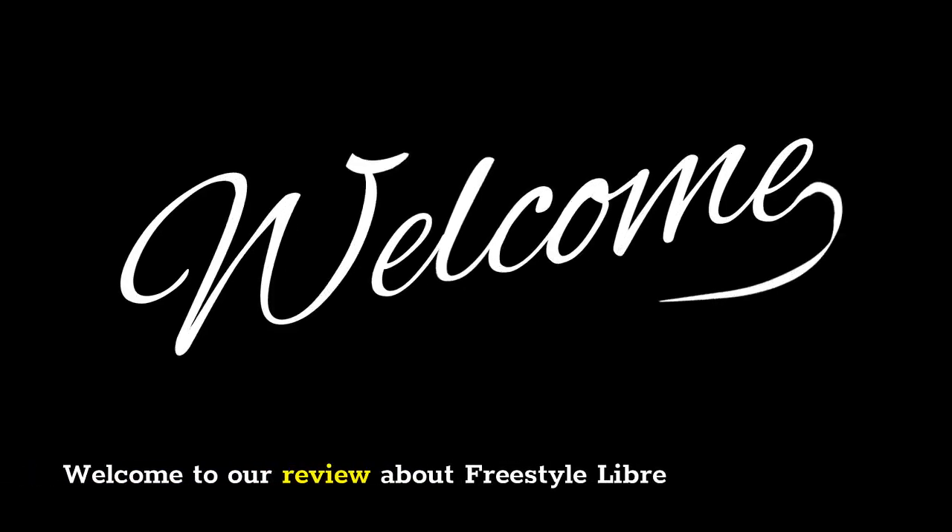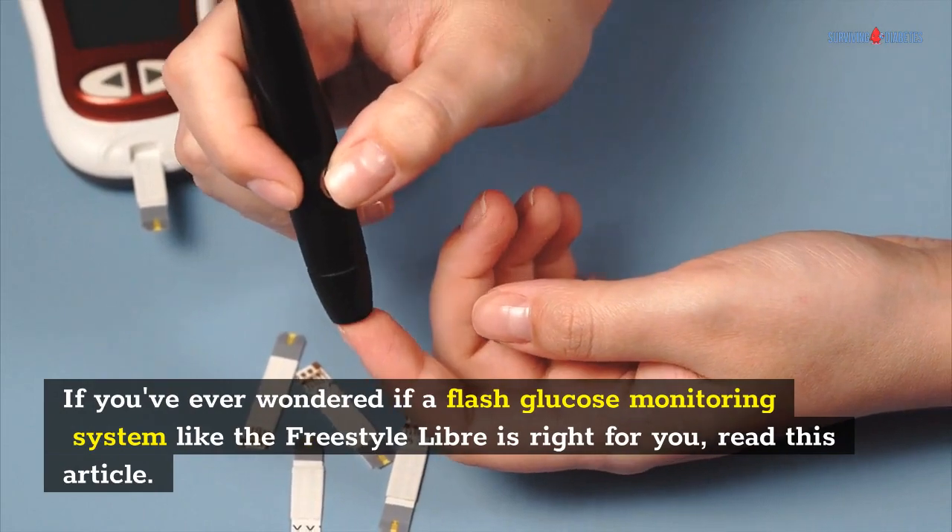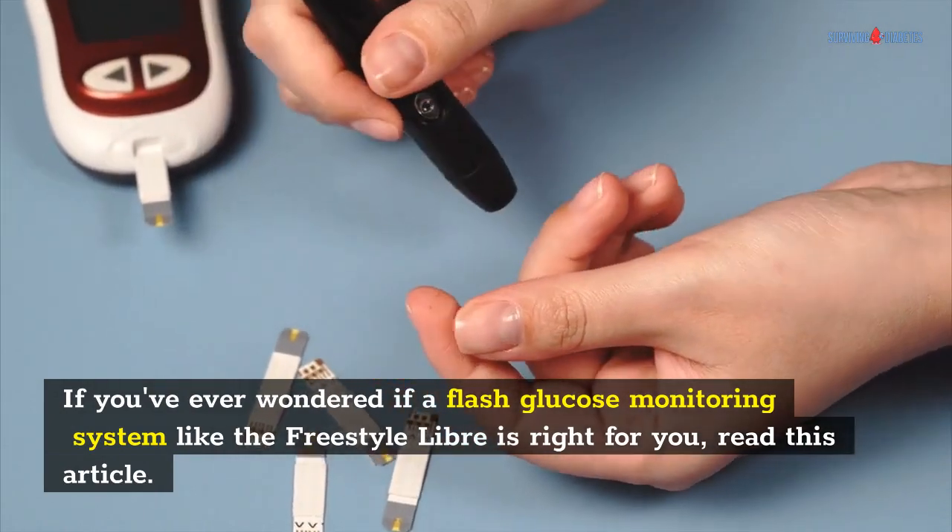Welcome to our review about Freestyle Libre. If you've ever wondered if a flash glucose monitoring system like the Freestyle Libre is right for you, read on.